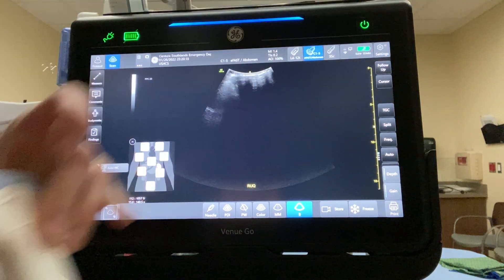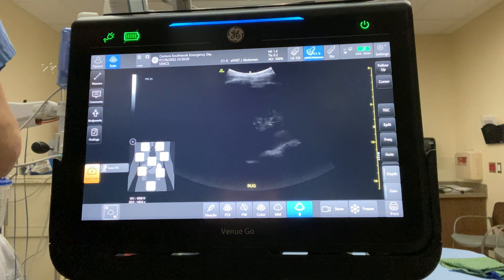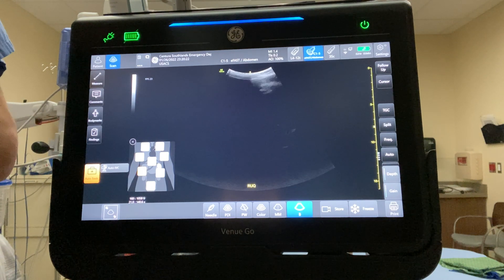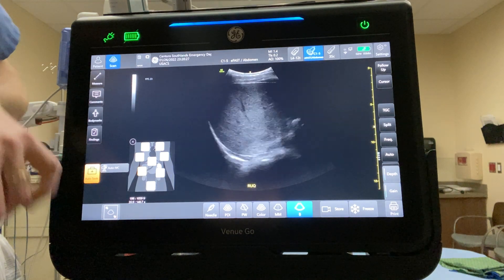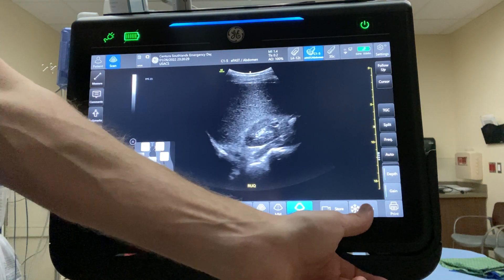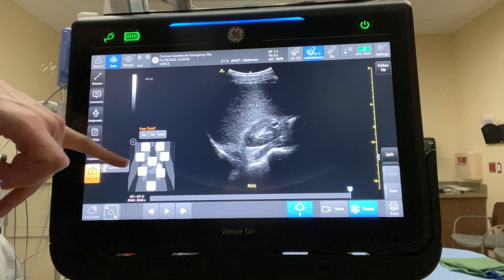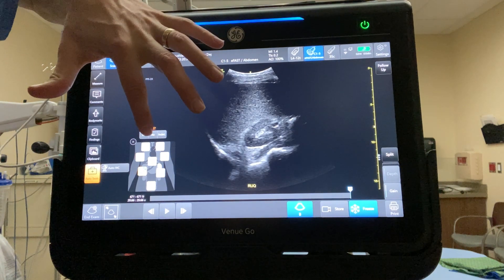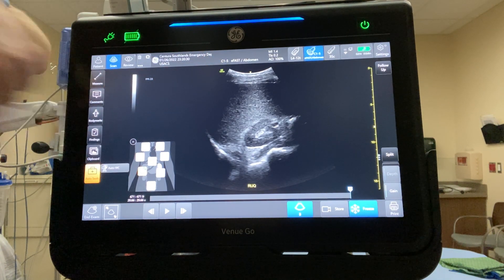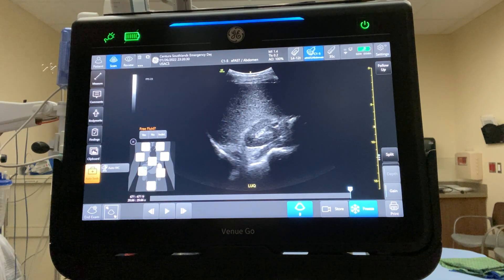Next, take your right upper quadrant image, freeze and store it, and it's going to automatically pop up in the corner. If you want to, you can indicate if there's free fluid or not. I'll say no, and it puts 'no' on the button. Then click across to the splenorenal area.